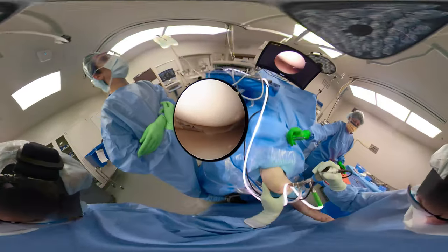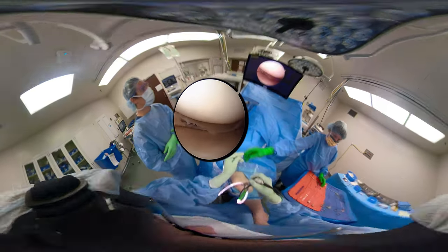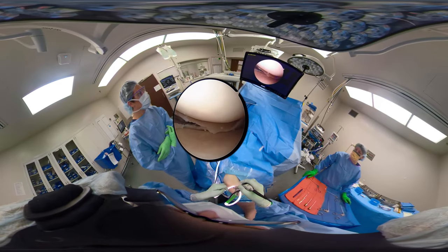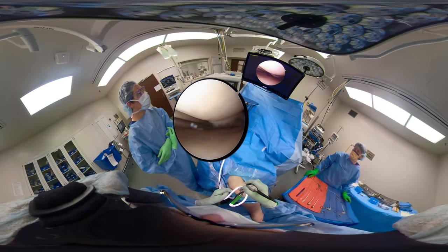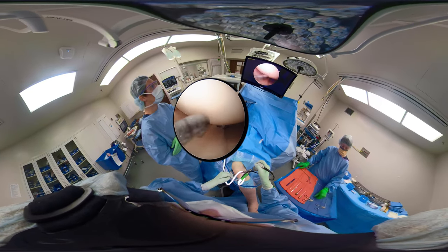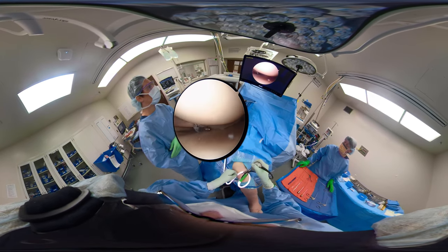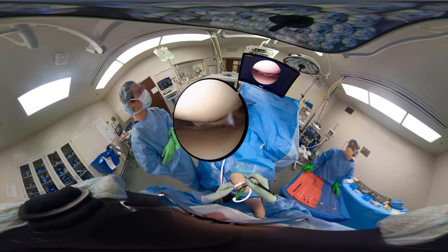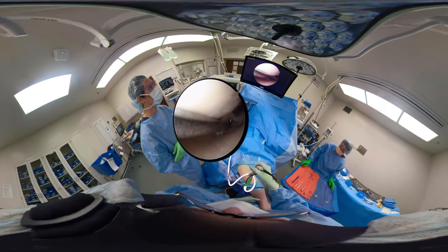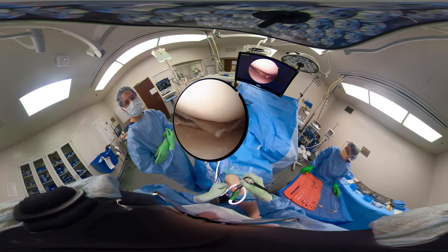Now I'm palpating that cyst to see if it got any bigger. If the cyst got bigger, I was contemplating doing an open excision of the cyst. We'll probe the remainder of the rim of the meniscus. You can see where there's still an undersurface unstable tibial-sided component that we'll need to look at and remove a little more on the tibial side. I try to estimate how much of the meniscus I take out — in this case, I took about 30% of it. Our scope is lateral, working portal medial still. To get to the anterior third, we have to switch the scope medial and come in from the other side.